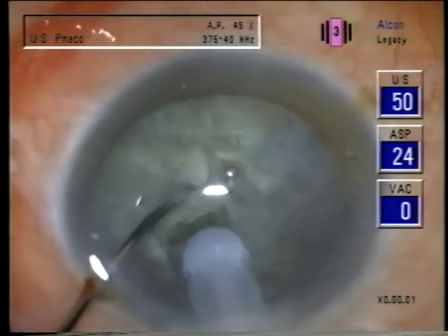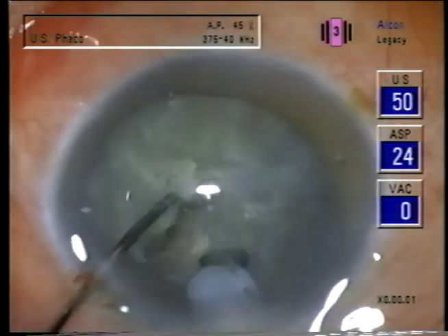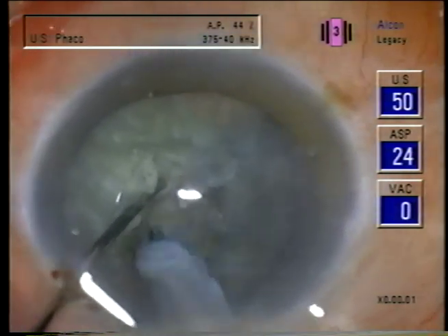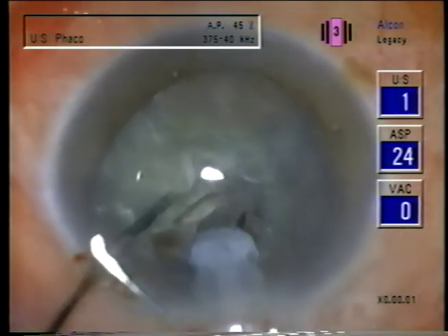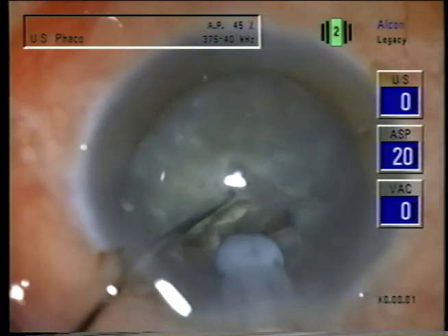So we're doing downslope sculpting. Notice I'm nudging the nucleus to be able to sculpt the upper part of the nucleus, and then a little phaco sweep to go right through the posterior part of the plate. There's no occlusion here and it's very safe.